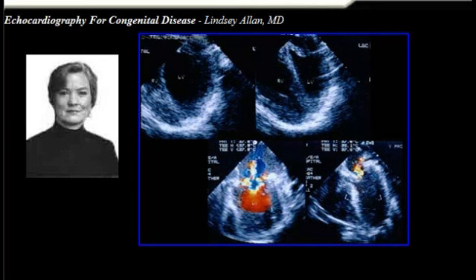And here are two examples where TEE has been very useful. Here we're replacing a pulmonary band in order to prepare the left ventricle for a switch procedure at a later age. And here you can see when the band was placed at first, the left ventricle dilated, the function didn't look so good. As the band was released gently, the left ventricle became more responsive and was contracting well as a result. So just this little bit of adjustment made a difference to this patient as it was coming out of the OR.